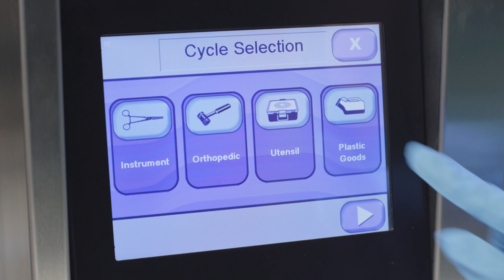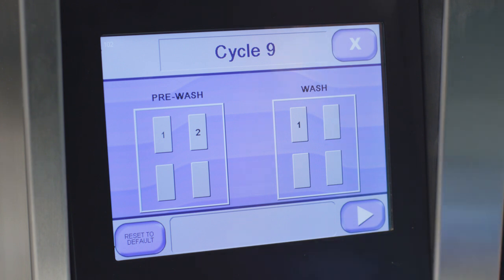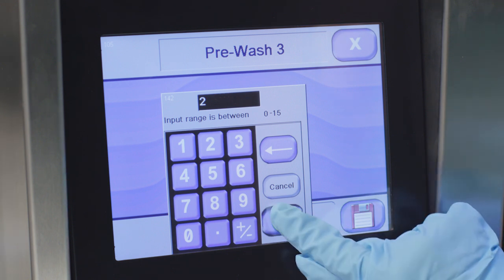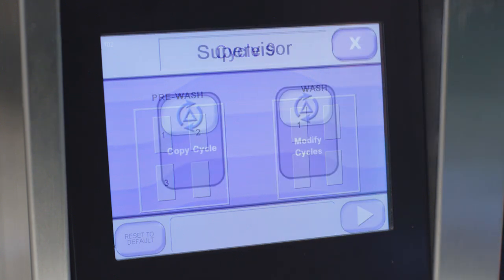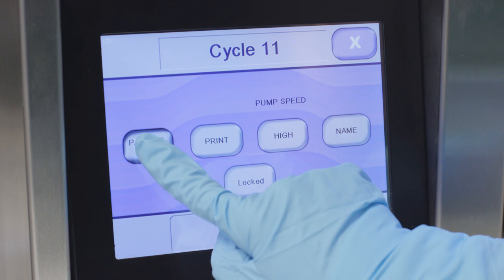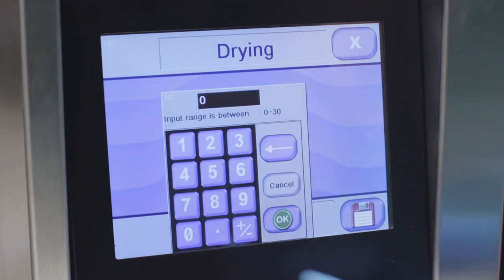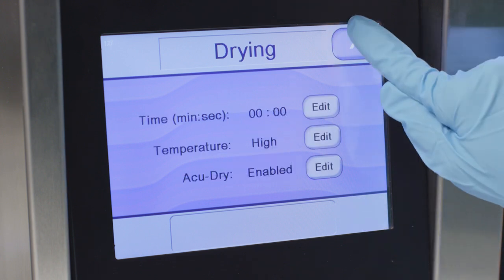To add a phase, click on modify cycles and scroll to the cycle you want to modify. Click parameters, then select the type of phase needed, such as pre-wash or wash, and click on a blank button. Then click edit and enter the amount of time for the phase you want to add. Then click OK, then click the save button to save the added phase. When you've finished, press close. To remove a phase, click on modify cycles and scroll to the cycle you want to remove a phase from. Click parameters, then select the phase you want to remove, such as rinse or drying. Then edit the time and enter zero. Then click save to remove the phase. When you've finished, press close.